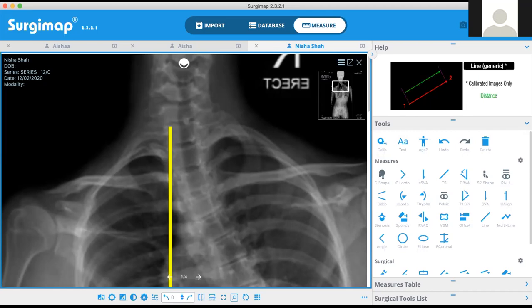But again, as Kshitij said, it's up to 2 centimeters. If it's more than 2 centimeters, then the whole thing changes. Then you have to change the measurement. Then you have to actually put that shoe raise and try to square the pelvis, and after that you take the X-ray. So again, you are assuming that all those things were done when the X-ray was taken.